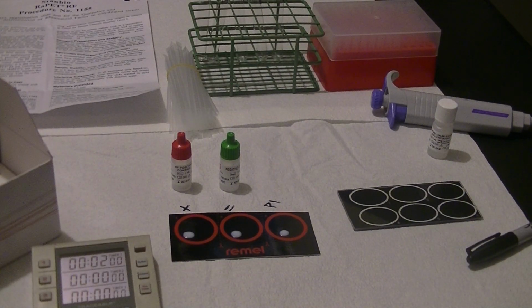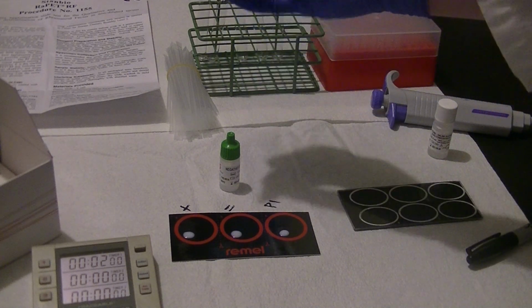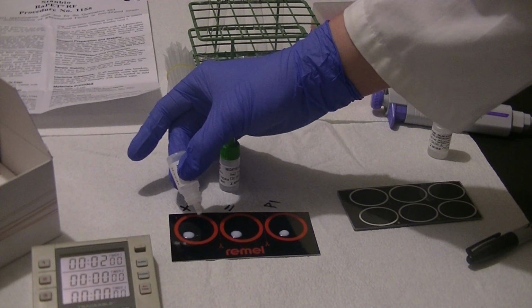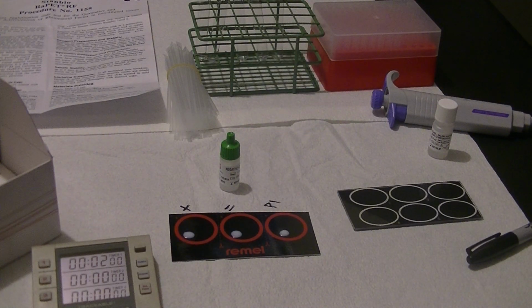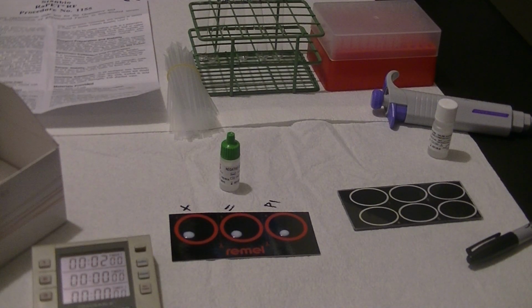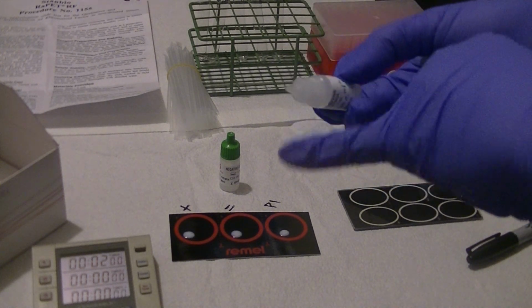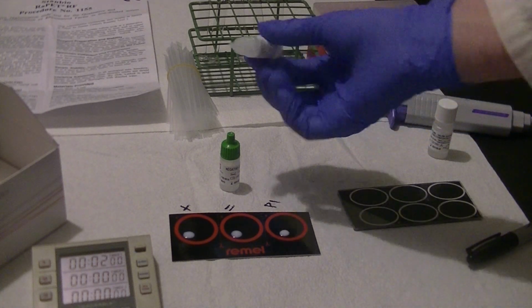The next thing we're going to do is add a drop of our positive control, again, roughly 40 microliters. And the reason we put our latex drop to one side of the reaction circle is because now our well-mixed positive control needs to be placed on the other side of that reaction circle. And the reason for this is we don't want there to be direct mixing of latex reagent with the sample we're testing, because it will cause contamination, or adding of latex particles to our positive control vial, and cause clumping in the vial.